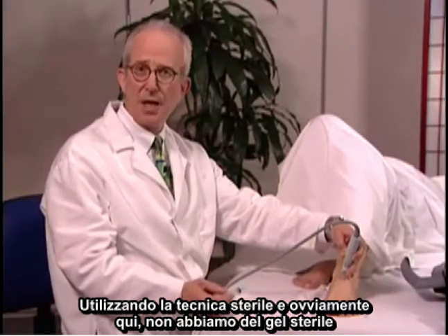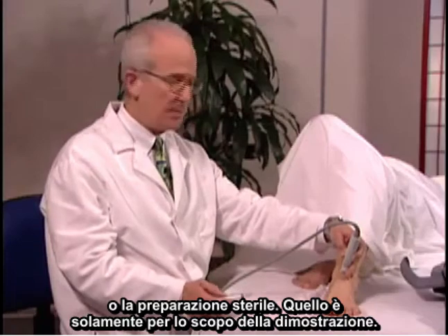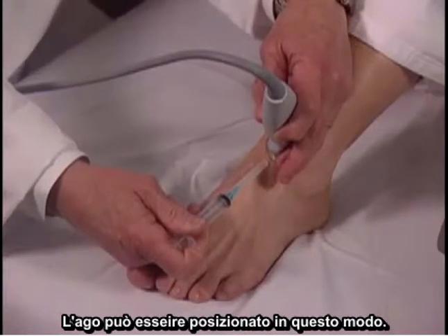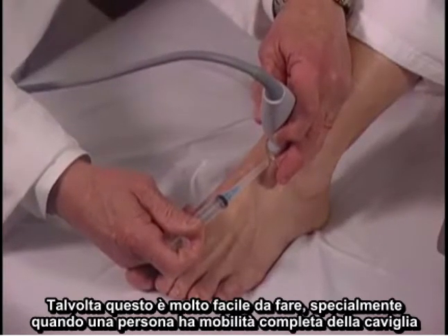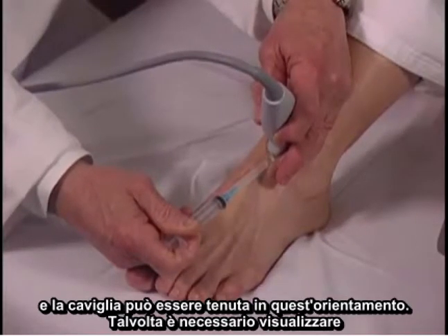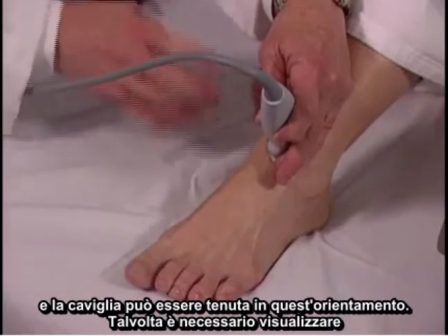Obviously here we do not have sterile gel or sterile preparation — it's just for demonstration purposes. The needle can be placed in this way. Sometimes this is very easy to do, especially when a person has full mobility of the ankle and the ankle can be kept in this orientation.